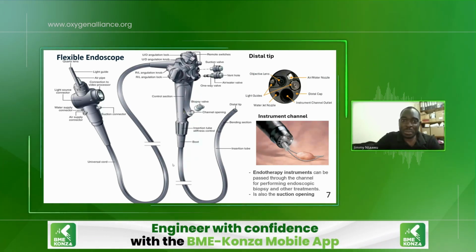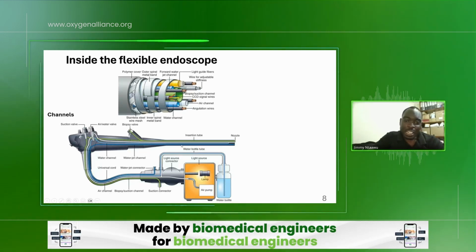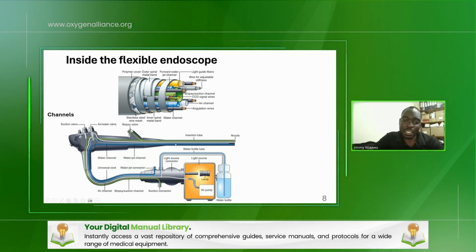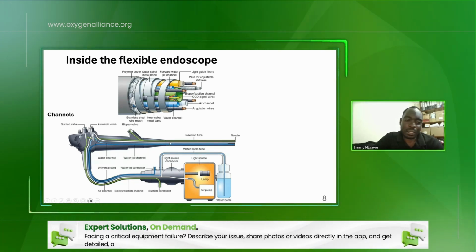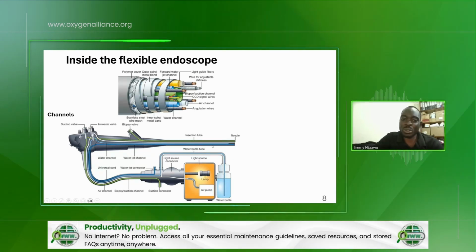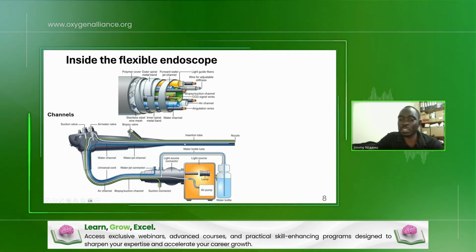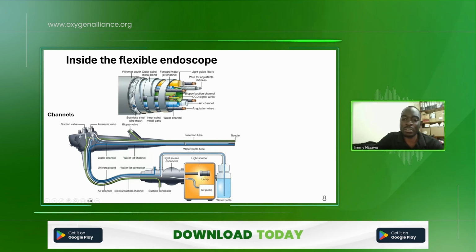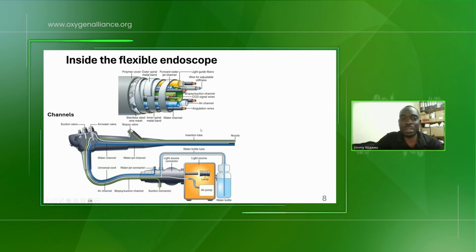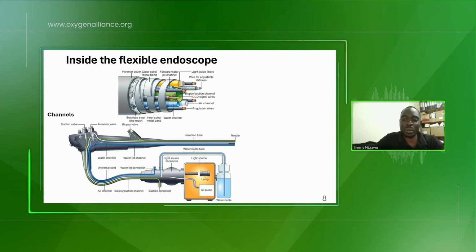I understand your problem, and this is where your answer is. In case that's the issue, then the problem is not here at the nozzle, but within the channel right here. If it's air, then the problem is with the air channel. If it's water, then the problem is with the water channel. It's quite a lengthy process, but it's something we can solve. So if you can reach out to me, I'll direct you on how we can solve it.